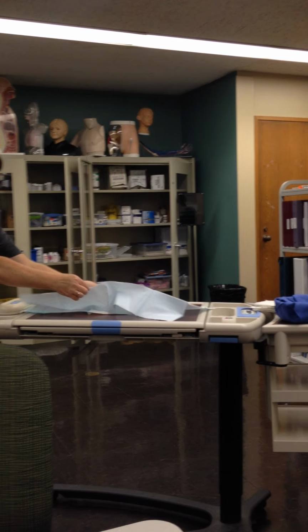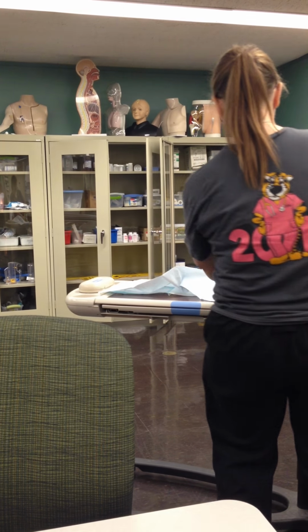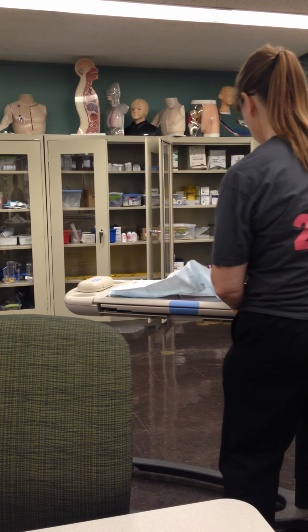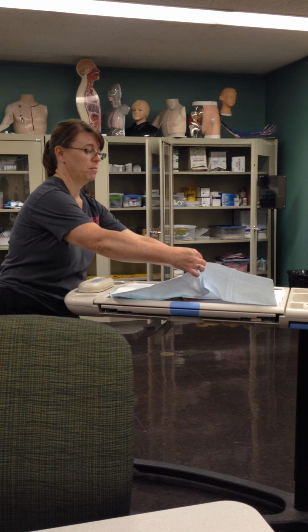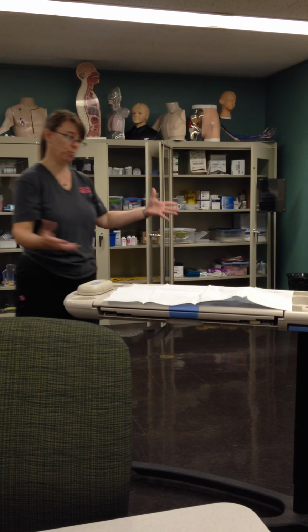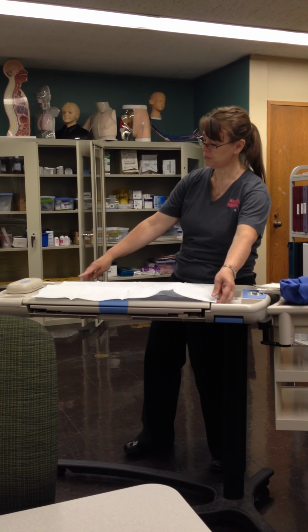And then you can walk around your table. I cannot reach across it. I can walk around it. And remember, in real life, I wouldn't be talking over it. After you guys have been practicing with these for a while, you lift them up and they just fall apart. So, I've got my sterile drape where I want it.